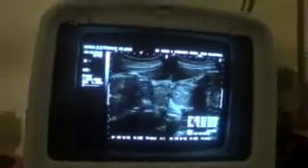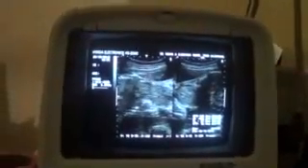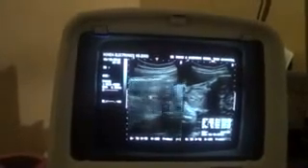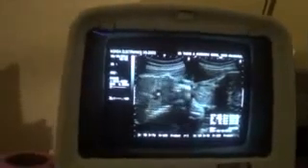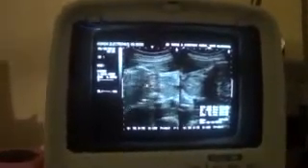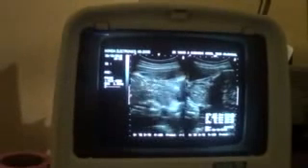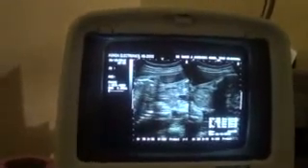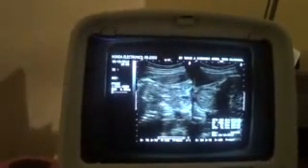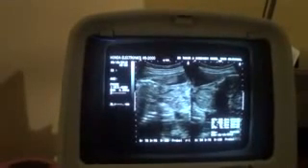pathology with the chest. Here you see, you can very well see the pulsation in these vessels. Here comes the heart, and this is the mass. So this is the heart, these are the vessels, and this is the lobe of the segment.